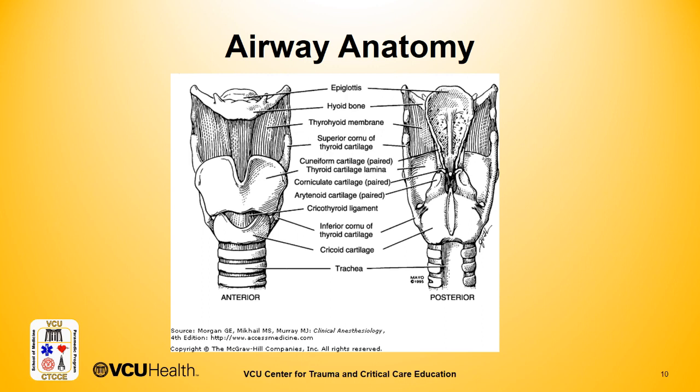This needs to be a controlled stabbing incision to get through the membrane. You do not want to stab all the way through the posterior side of the airway, but you want to have a controlled entry through the cricothyroid membrane in a controlled stabbing motion and then create that incision across the membrane.